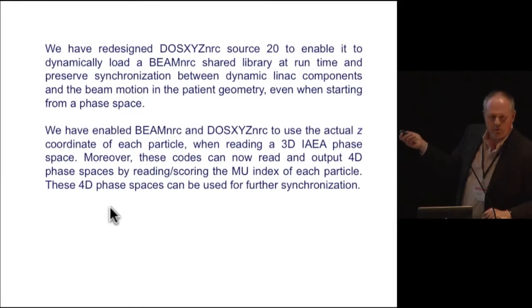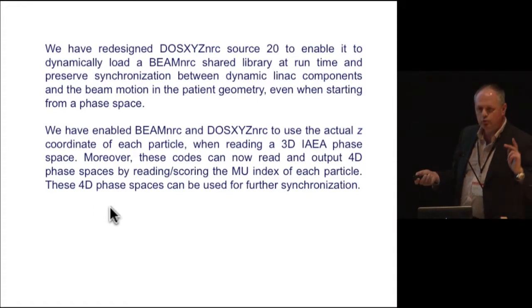But since we were there, we didn't stop at just the Z coordinate, and we found it useful to actually enable both BEAM and DOSXYZ to read and write 4D phase spaces.